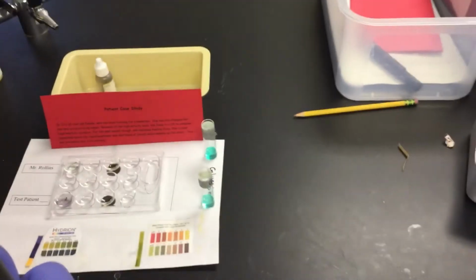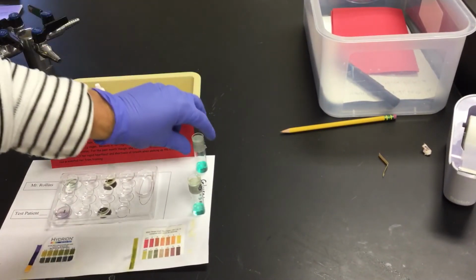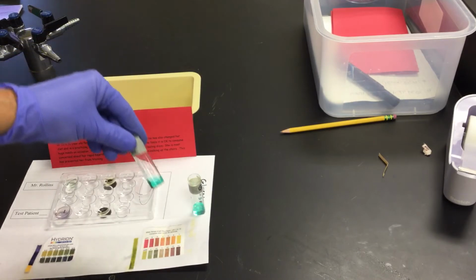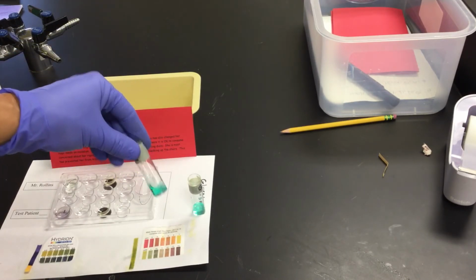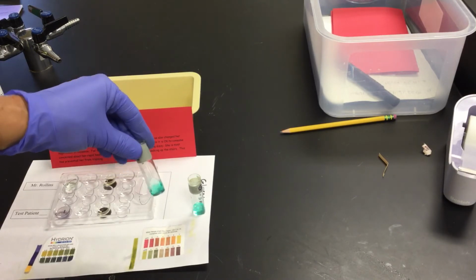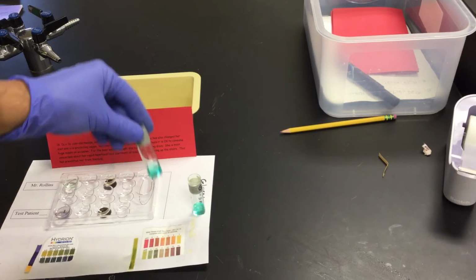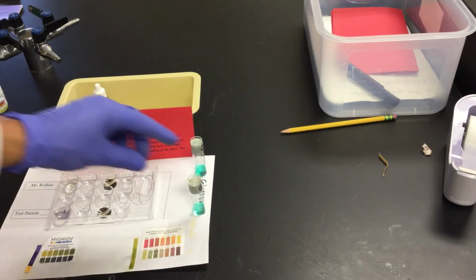Next, we want to look at glucose. So our glucose sample, does it have sugar within urine? Remember, we don't want sugar within urine. So our control patient, Mr. Rollins, we took his urine, we added Benedict's solution to it. When we were done, we put it on a little heat. This is what we end up with. It looks like what we started with. So we said Mr. Rollins was normal for glucose. There was no glucose in it because we don't want glucose.